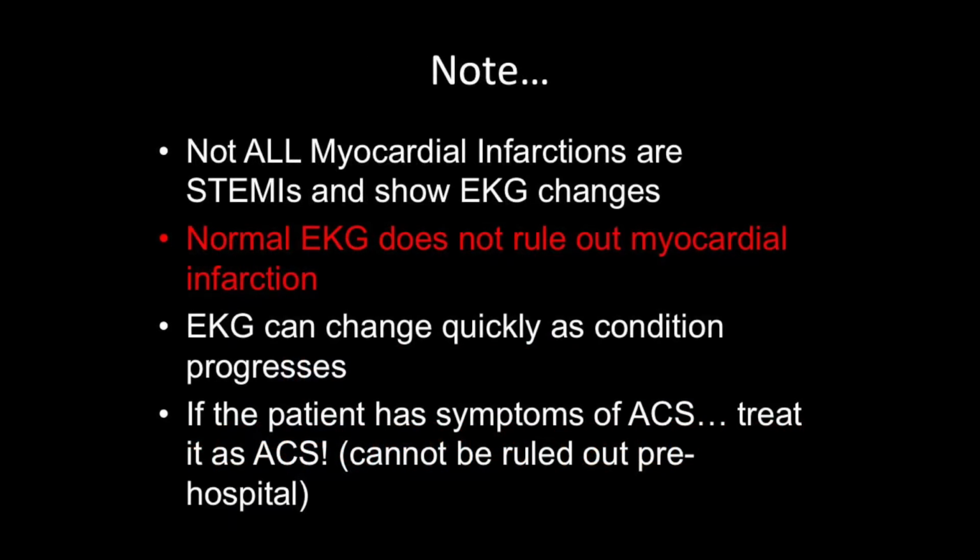Not all myocardial infarctions show up on the EKG. So you may perform an EKG and the 12 lead says it's normal, there's no issue, and this person in fact has an MI. Okay? So that's why I'm stressing, do not look at whatever comes out of that box and say, that's gospel, this is it. Look at your clinical presentation, and if you feel they're having something cardiac, you treat that. You manage that, regardless of what the machine says, okay?